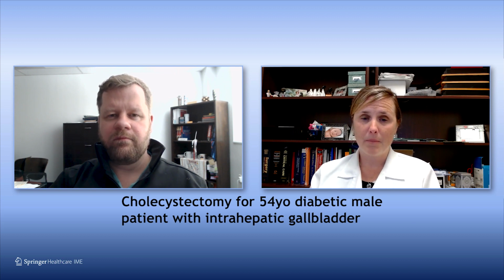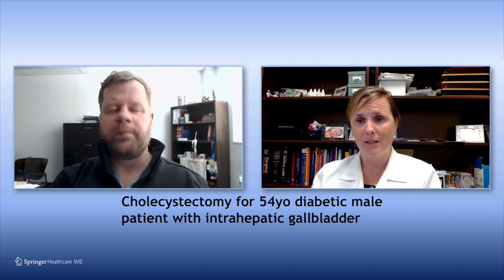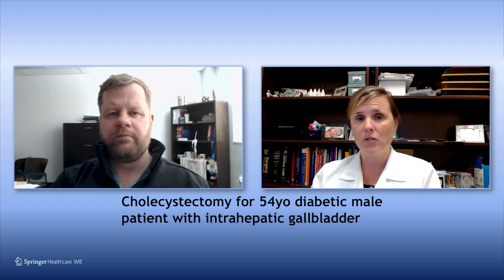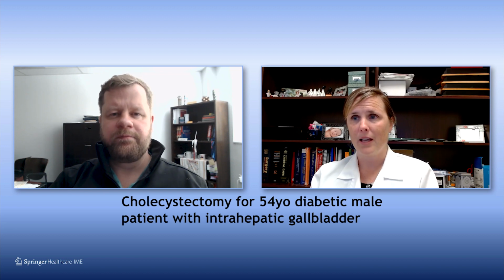Again, this is going to potentially be a really irregular surface, depending on the shape of the gallbladder and really of the liver bed now that the gallbladder has been excised. And so it may not be overly easy to apply that. And so you might end up wanting to go more with a flowable just because of the ease of application. And again, this is laparoscopic surgery, so you have to think about what kind of applicator do I have? Am I going to be able to put this on laparoscopically?